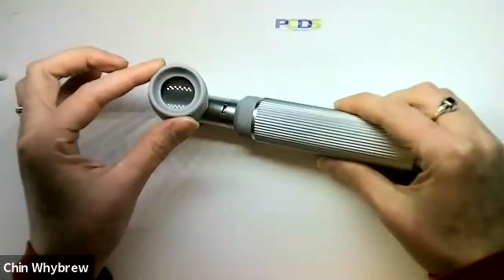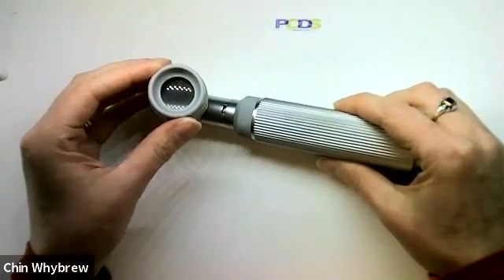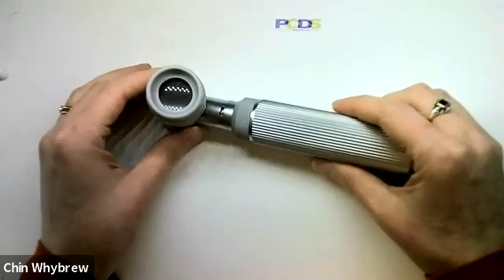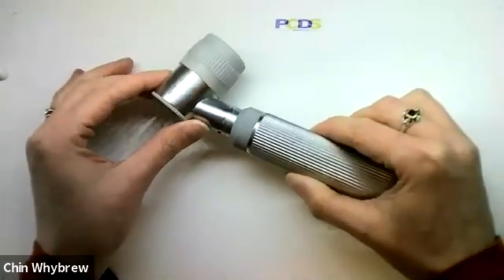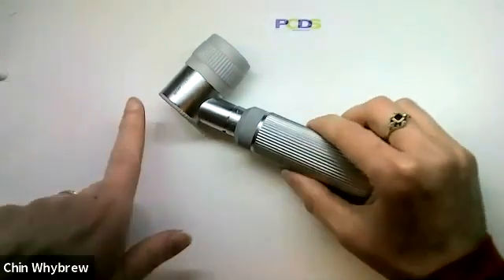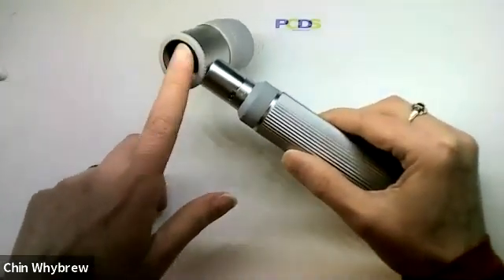This has six times magnification, so it's not the standard ten times magnification that you would get with an ordinary hybrid Dermatoscope. And there is no polarization to the light, so this is just plain light that you're looking at, so you must always use it with contact fluid.